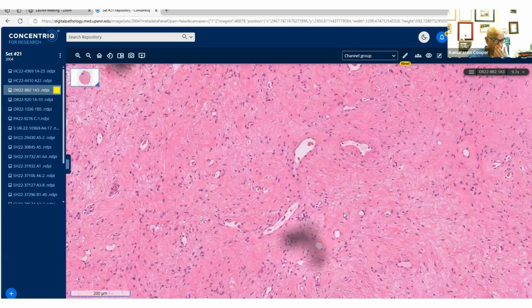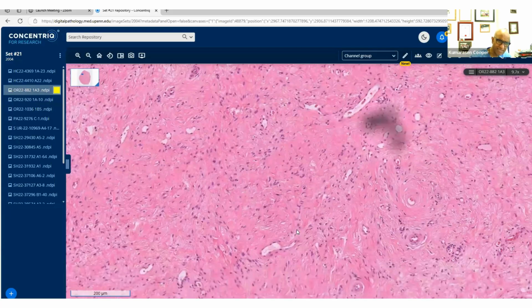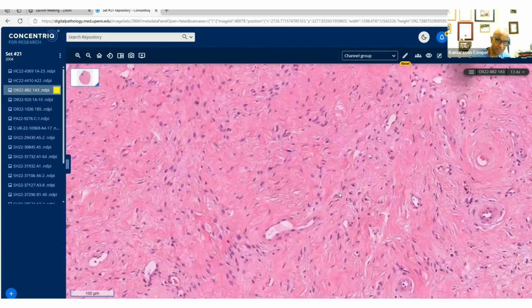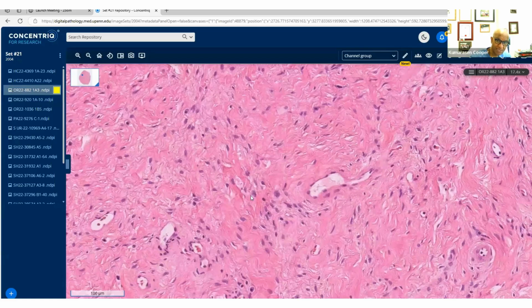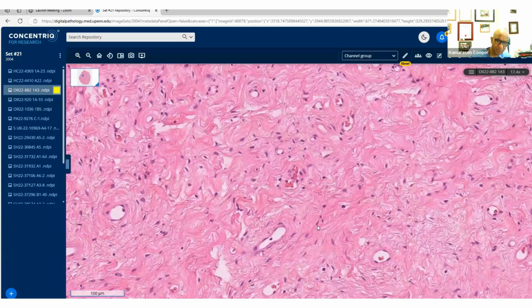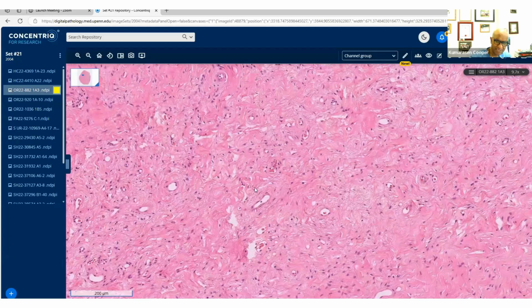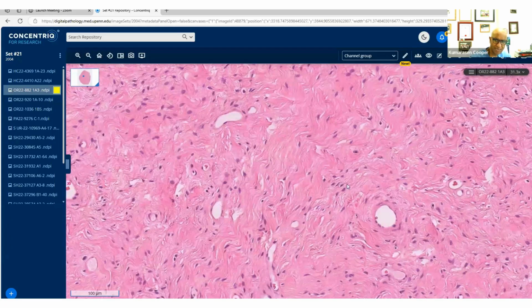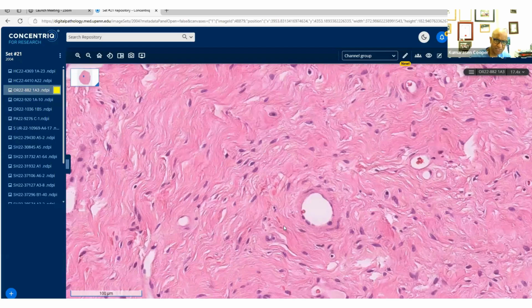And this would be a really classic example, because of those capillaries, hyalinized, small, and then these spindle cells. The cellular angiofibromas can vary in cellularity. This doesn't look very cellular. You may argue it's not very cellular, and you would be correct. It's probably more sclerotic and a little older, if you like, and probably lost some of its cells. But that's exactly what it is, a cellular angiofibroma here, just to show you these nice hyalinized capillary sized vessels.